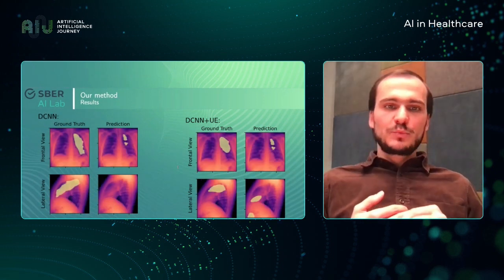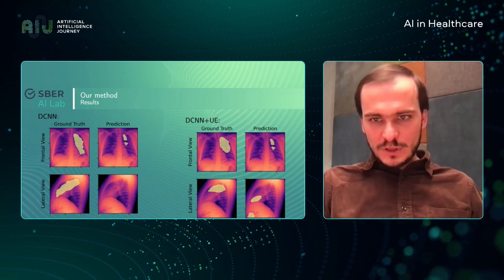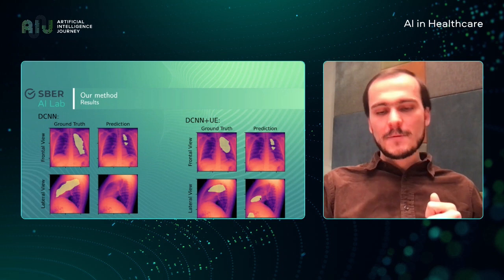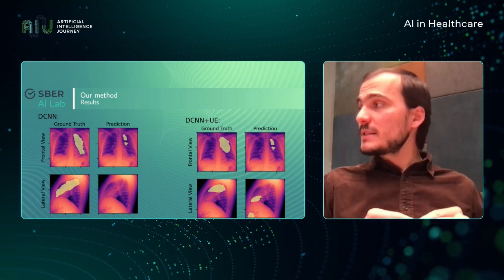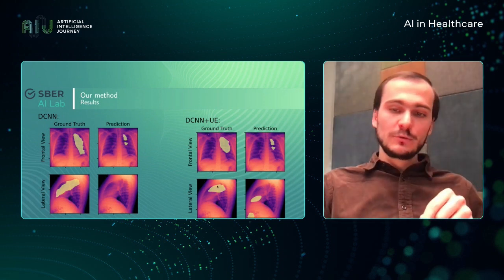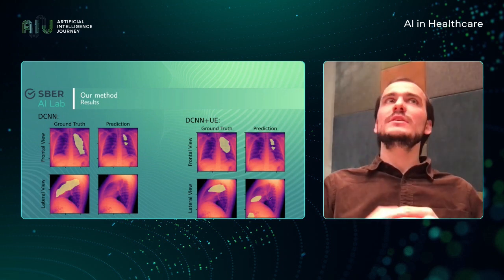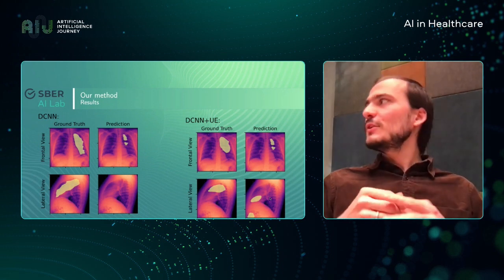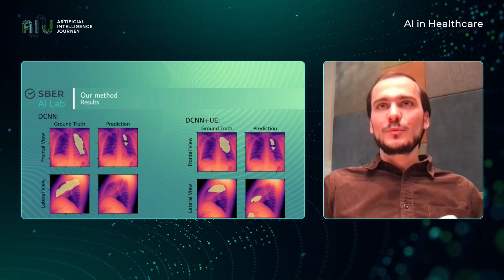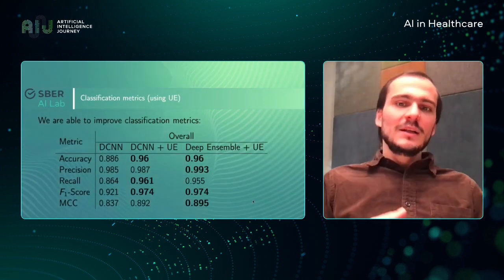At the same time, so far, this approach has its drawbacks. On the picture to the right, you can see that the doctors' segmentation is not in line with what the model says. But we need to make one comment here. Two other doctors, for this particular case, segmented a larger area, and it coincides with what the model predicts. So for some cases, there are no overlapping areas with the model, but this is not true for all doctors.